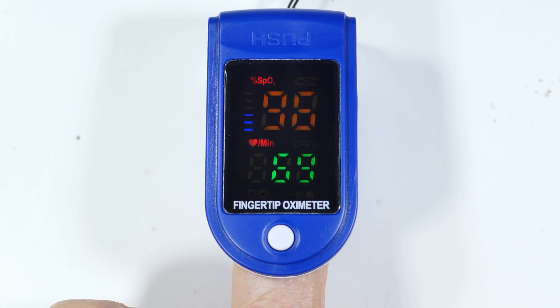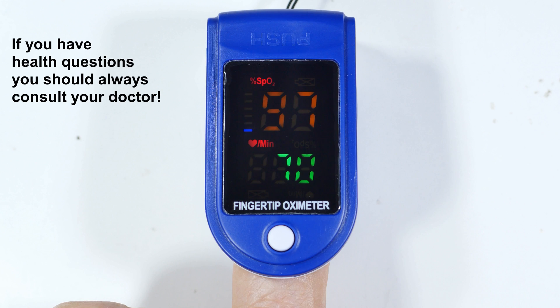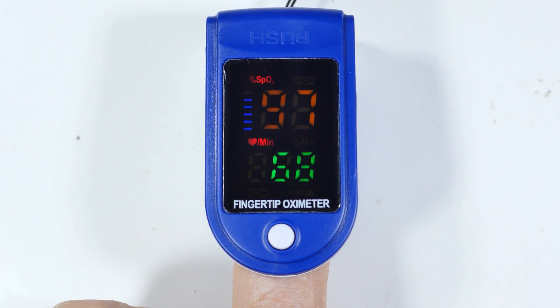I wouldn't recommend this for replacing a medical instrument, but if you just wanted something around the house for convenience — like having a regular thermometer around — it's not medical grade but it'll tell you if you have a fever or not. This is probably adequate for determining if you're within the ballpark on both your pulse and blood oxygen content. You can actually see the pulse going on here. It's not medical grade but it's something interesting to keep around, maybe while you're exercising, just something to play with. I hope you found that useful for your home health care.